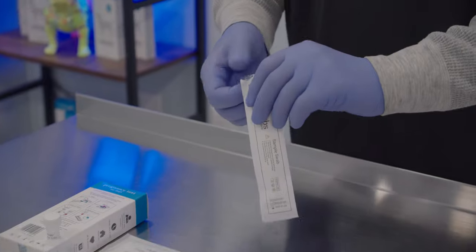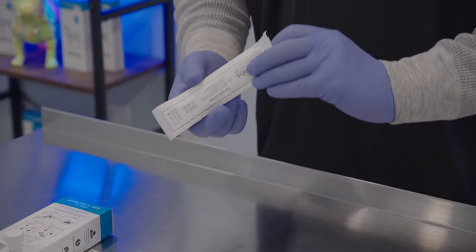Once the lancet has been used to expose the blood sample, we then use the included cotton swab to collect the blood sample.